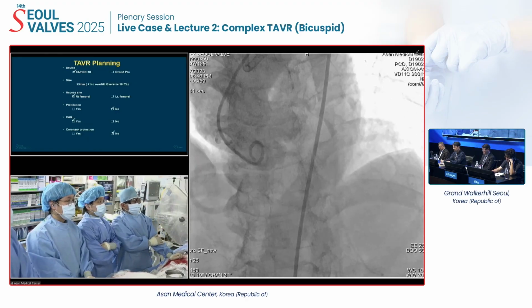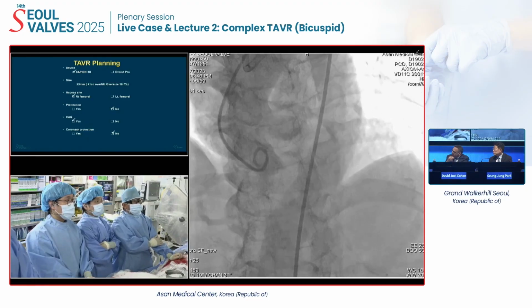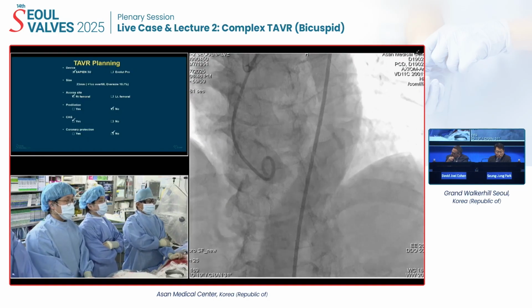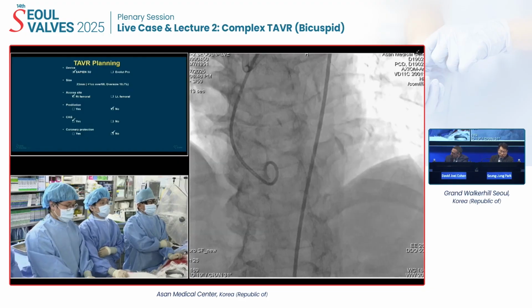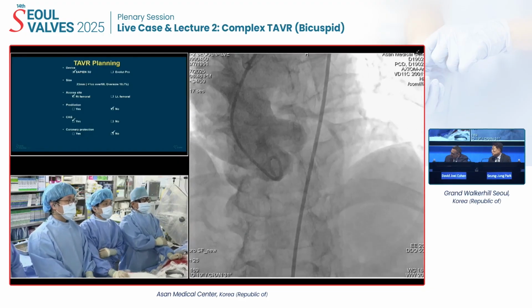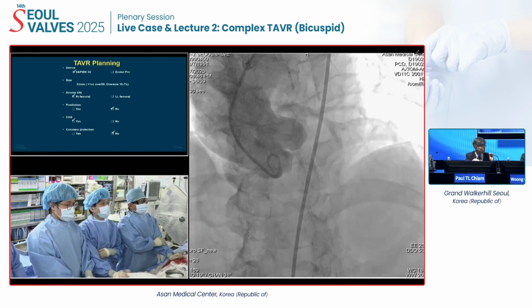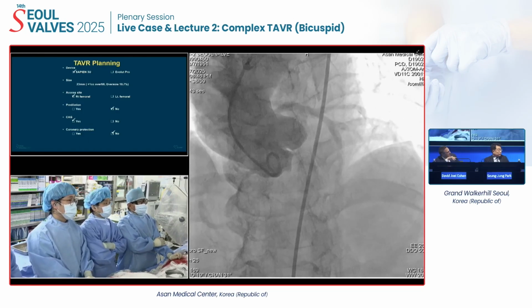So anybody on the panel, anybody not want to treat this with a TAVR? Would this patient get a TAVR in your center? Yes, I think so. I think the anatomy looks suitable. The coronary heights are high, and now with the SAPIEN 3 Ultra RESILIA, I think this will be a good choice for her. Anybody down here to my left? Anybody want to weigh in?